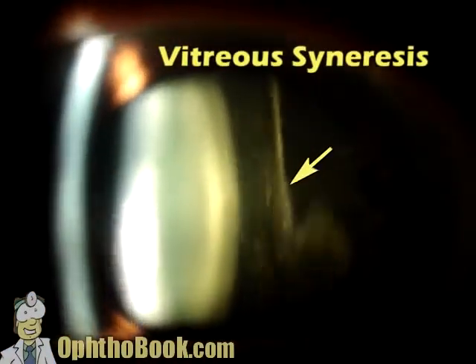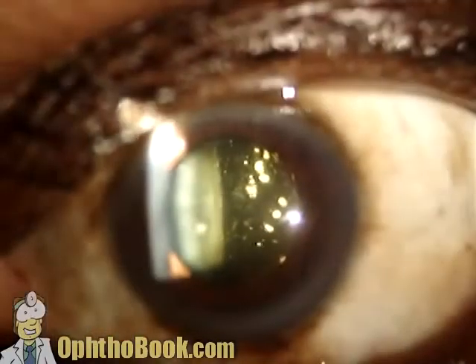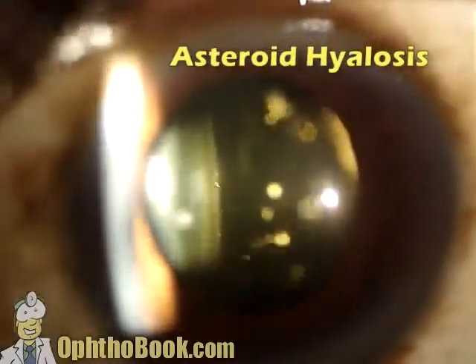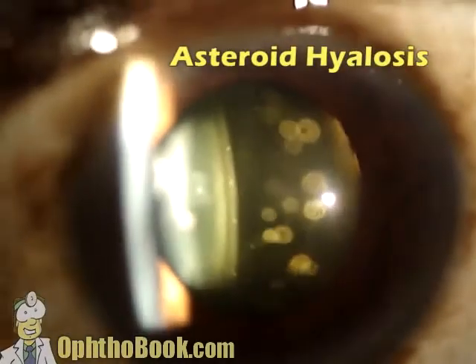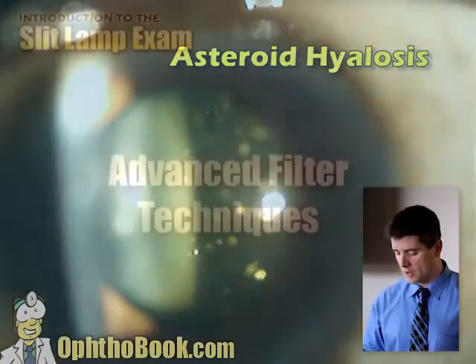This is a vitreous detachment. You can see just sort of a sheet back there like a curtain, and that's just that vitreous jello contracting. And finally, this is a case of asteroid hyalosis, which is a calcium soap deposit that forms in the vitreous body, forms these little floating stars in there. They look impressive, but they don't cause a whole lot of visual problems for the most part, and they don't really indicate any real eye pathology.